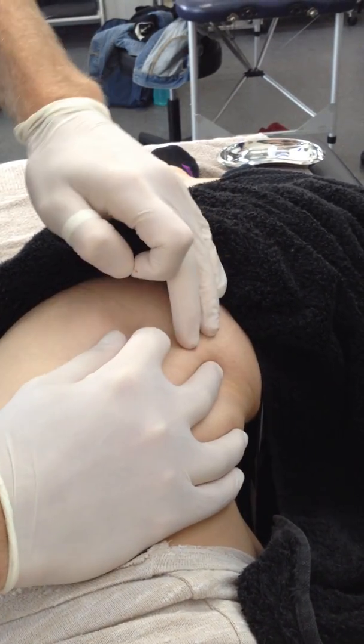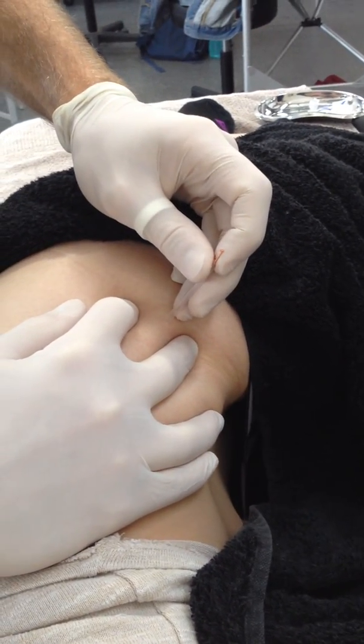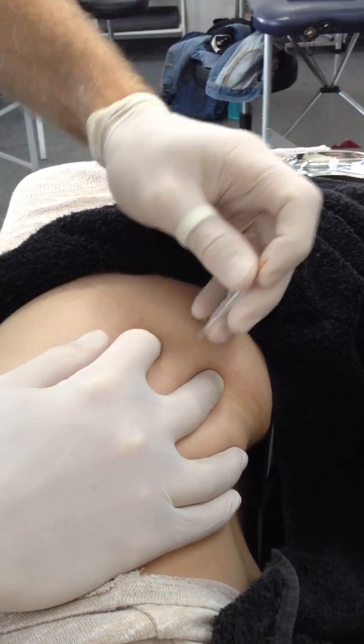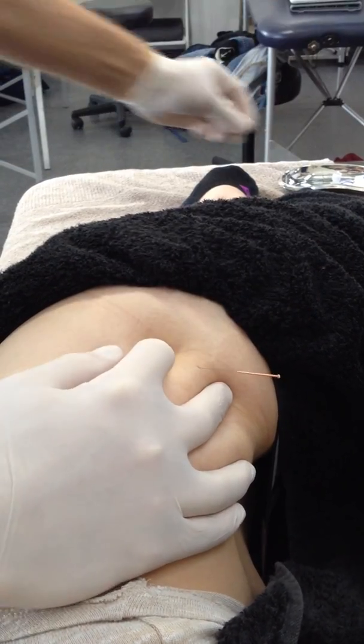No real precautions with this — it overlies the glute min unless you're needling really deeply and actually pass through that. You would still have to pass through glute min to get through to the hip capsule. Go there, get that straight in.